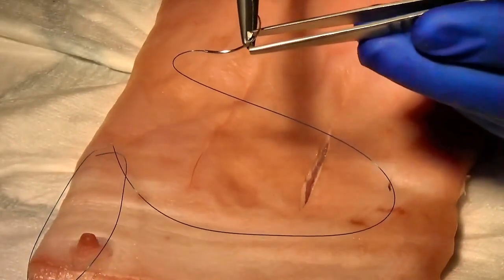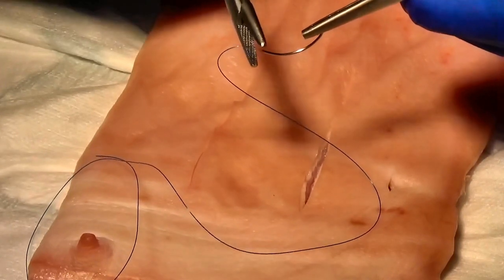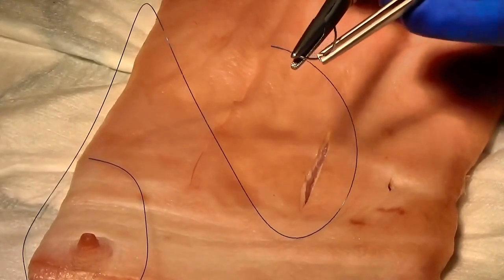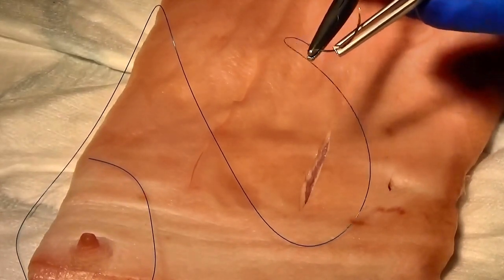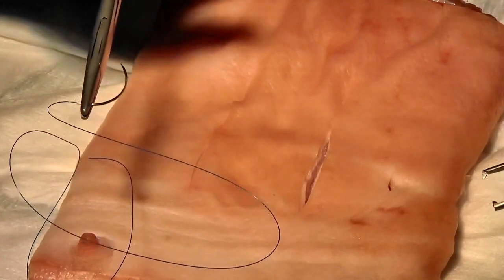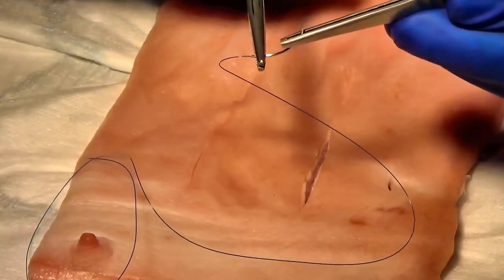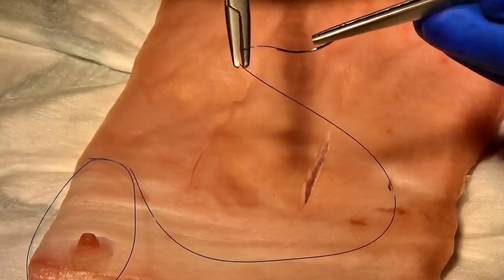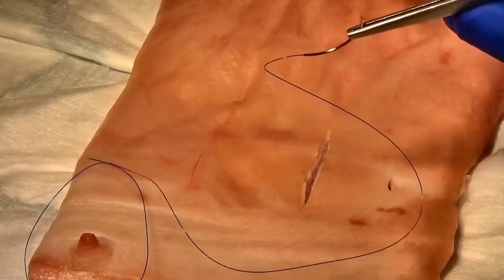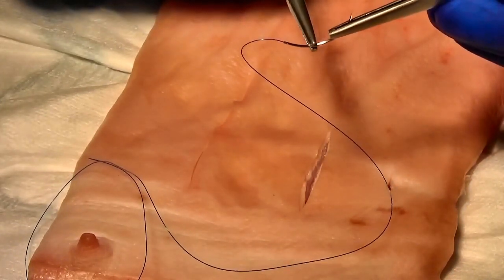That's acceptable. Don't mount it right at the end there. Don't mount it there because the needle rotates. Never do that. You will damage the suture material. So mount it about 1/3 of the way along.